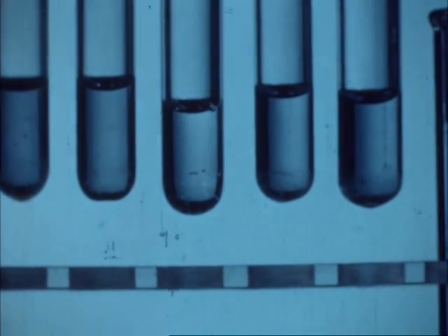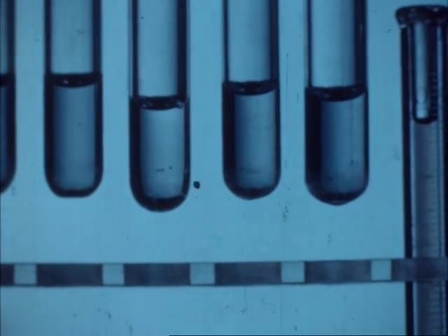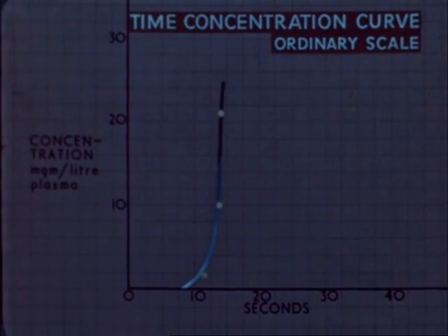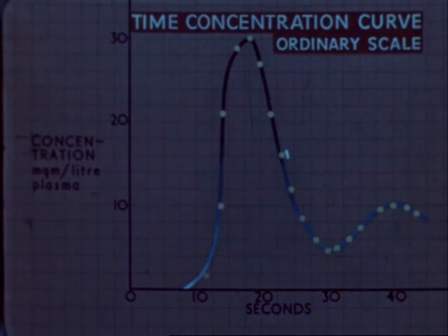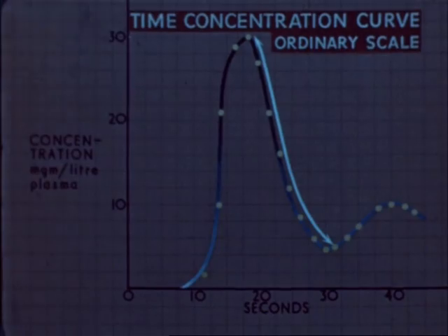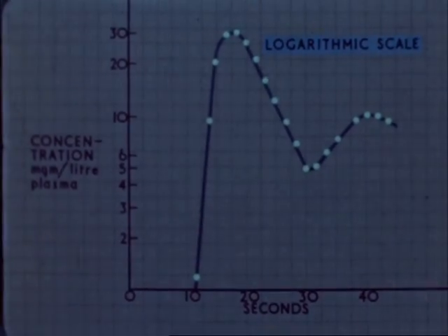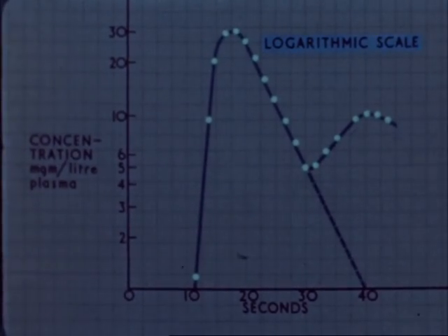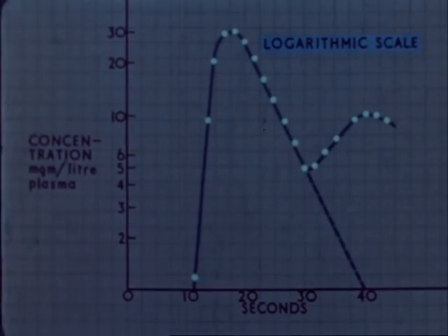Dye concentrations are read in a sensitive photoelectric colorimeter and the reading noted. The exact concentration of each sample is now plotted to make a time concentration curve. In this case, the recirculation causes a secondary rise before the baseline is reached. If, however, the concentrations are plotted on a logarithmic scale, the falling concentrations form a straight line, which may be extended to the baseline, giving the curve representing one circulation only.